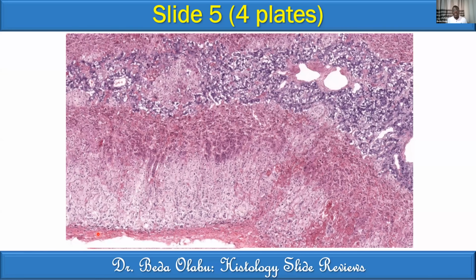What's unique about the adrenal gland? Let's start with the adrenal medulla there. The cells of the adrenal medulla are in a cluster morphology, and there are several large vascular spaces within the adrenal medulla. Remember the cell types of the adrenal medulla, we have the chromaffin cells and the ganglion cells. And I hope you remember their functions.